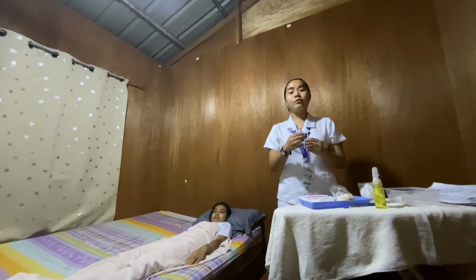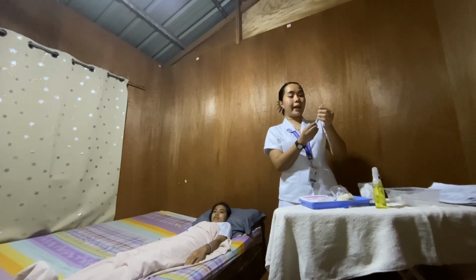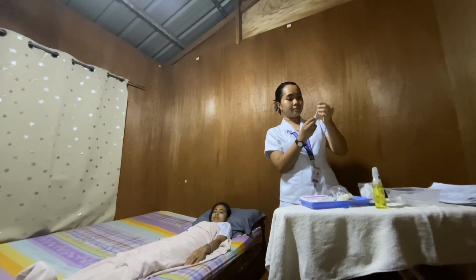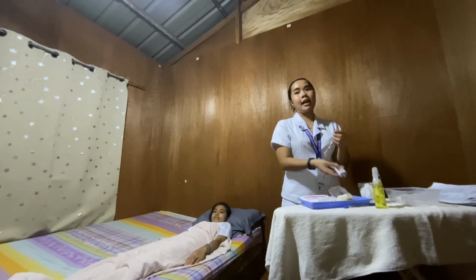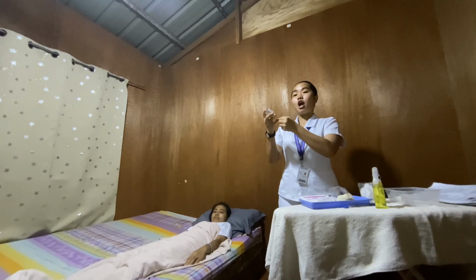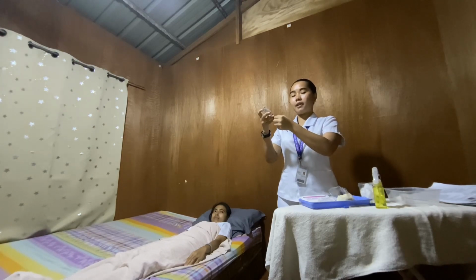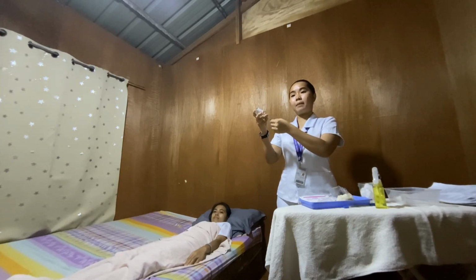Next, remove the cap from the syringe, then draw up into the syringe an amount of air equal to the volume of the medication to be withdrawn. Then carefully insert the needle into the upright vial through the center of the rubber cap, maintaining the sterility of the needle. Then inject the air into the vial, keeping the bevel of the needle above the surface of the medication.